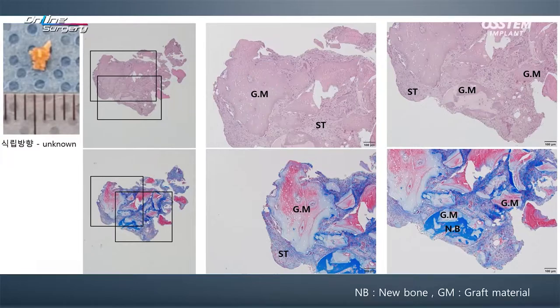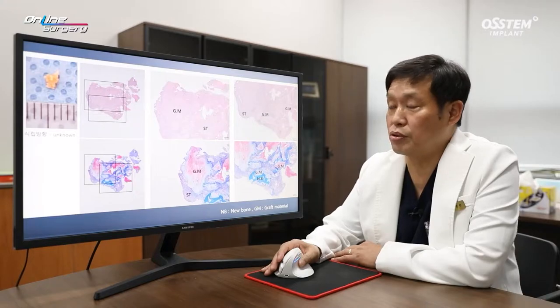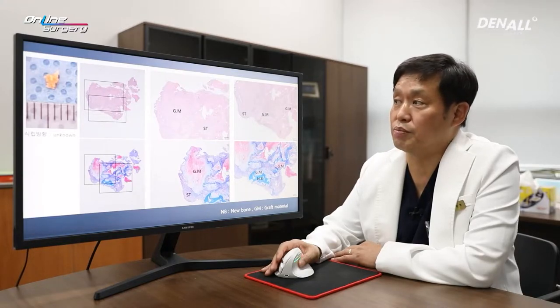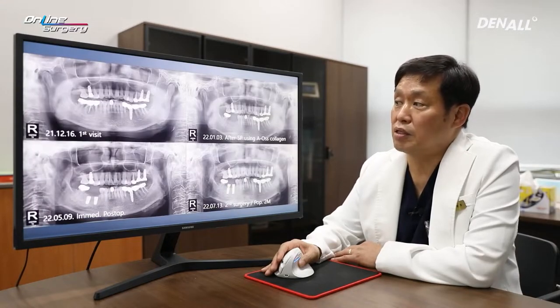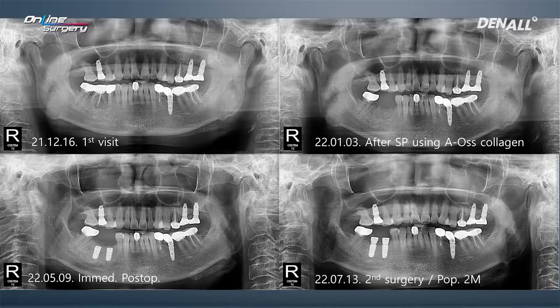You can see that this is progressing in a favorable manner. At the initial visit, the patient had periapical lesion, and in January socket preservation was done using AOS collagen. In May, after 4 months, implants were placed and second surgery was done.